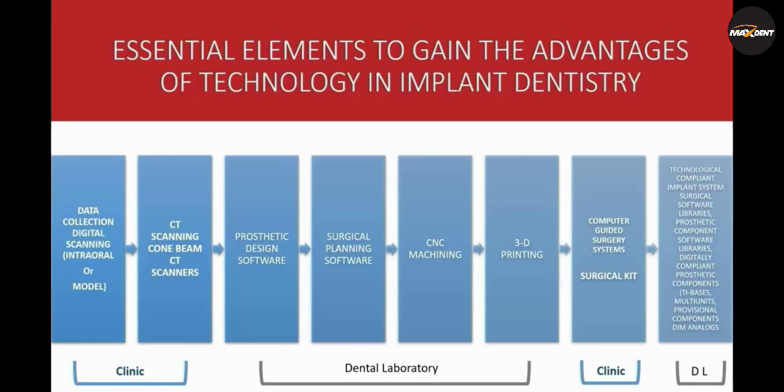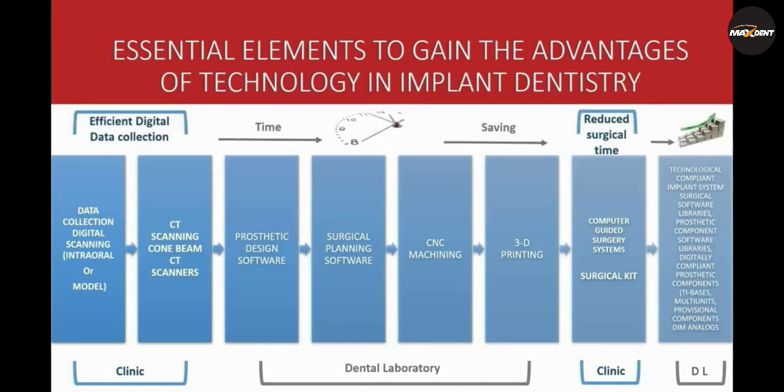today, the dental laboratory takes a major role in digital technologies, such as the prosthetic design software, surgical planning software, CNC machining, milling, 3D printing, and prosthetic components. This workflow will be both time efficient and cost saving. Your first appointment may include taking medical history, clinical images, CBCT, and an intraoral scan.